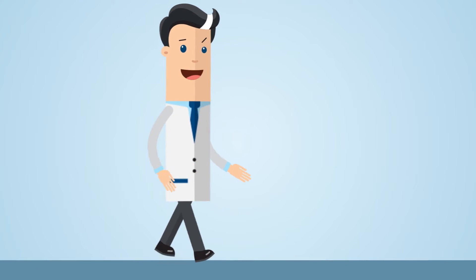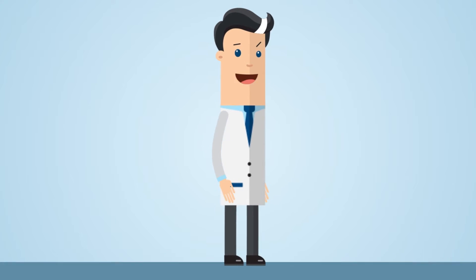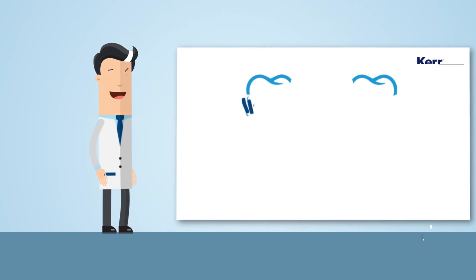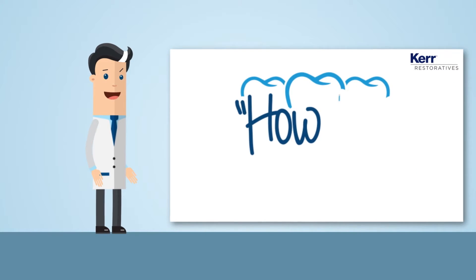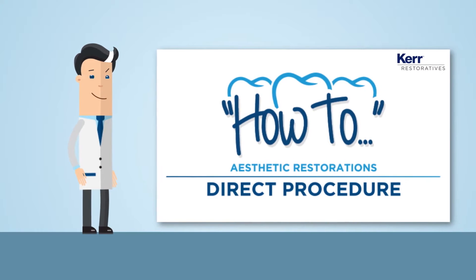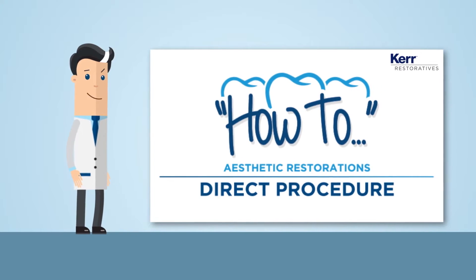Getting great aesthetic results is what sets you apart from everyone else. So today we're going to take you through the steps for an outstanding anterior direct restoration, using products that can give you the results you want.